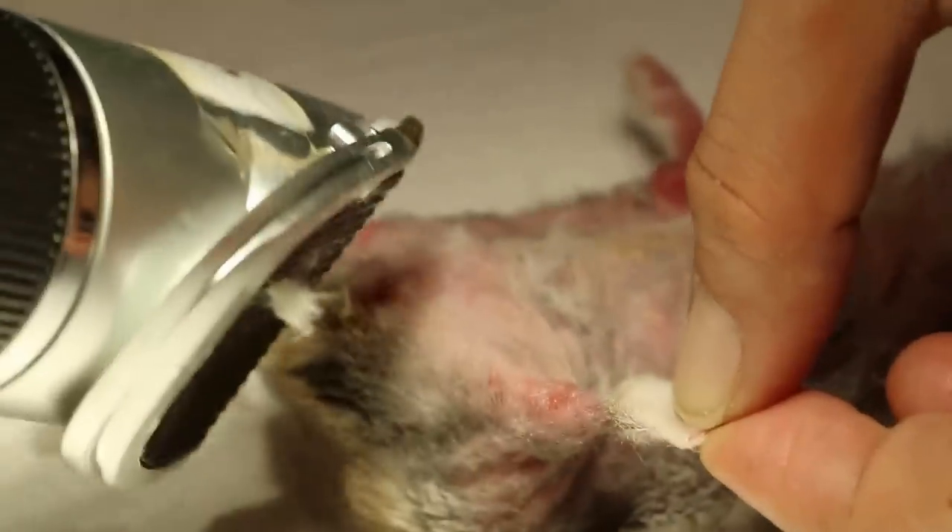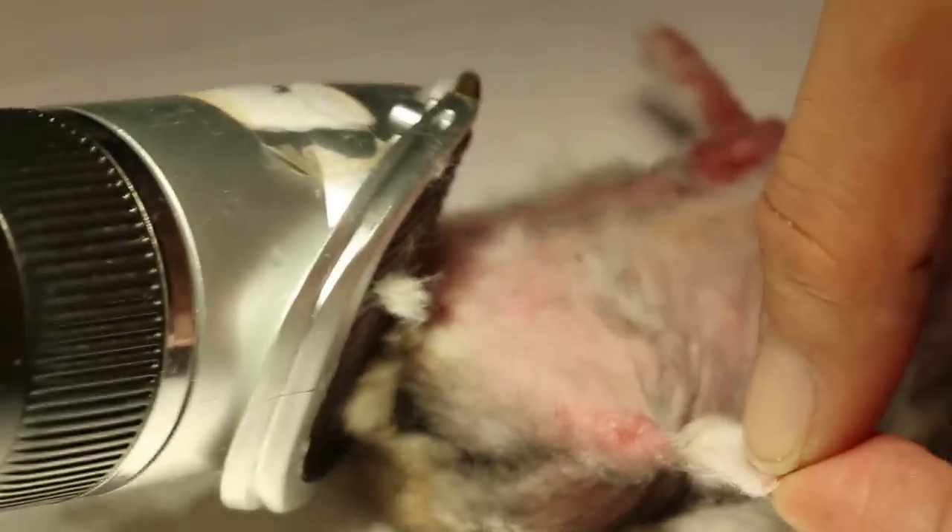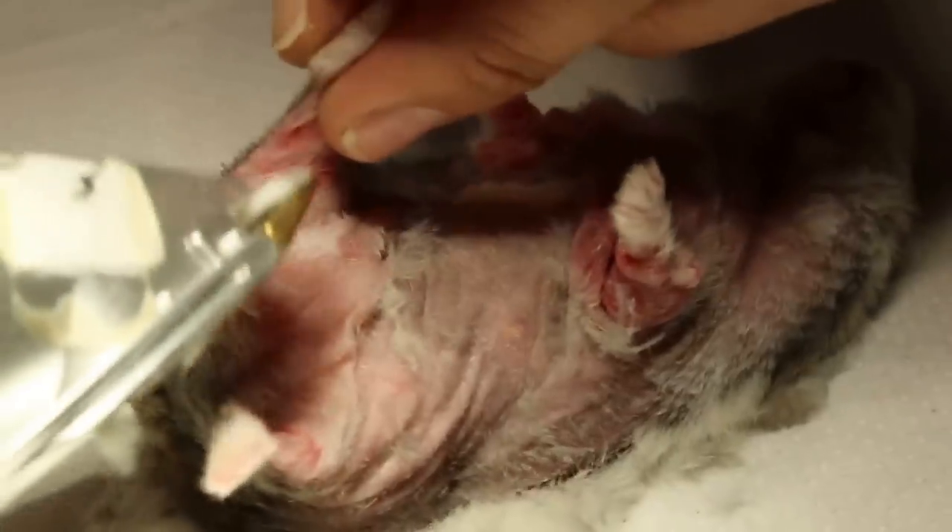Then you continue with his back legs — you can see there. And bacteria will come in, and maybe some fungus as well.